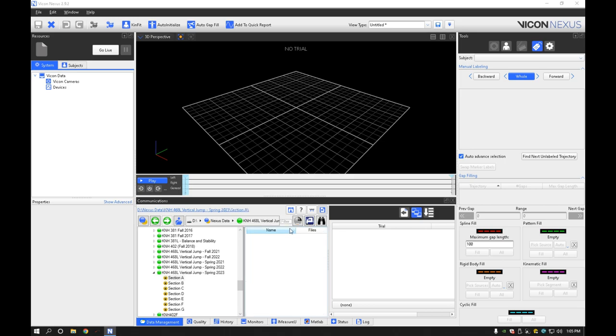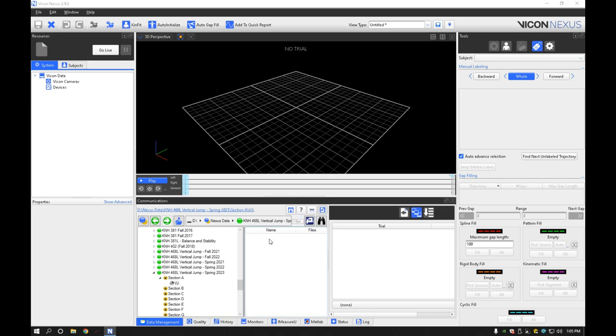So let's go ahead and bring up one of the sections. We're going to go into that one and now we're going to create a session. Here we're going to just call it vertical jump. Easy peasy. Now that we're within this VJ, the vertical jump, we are good to go.